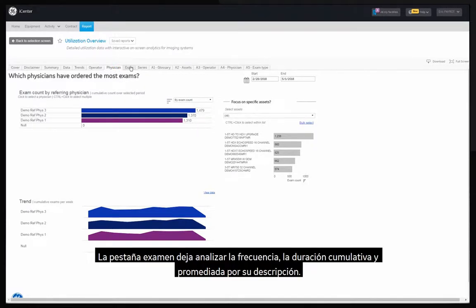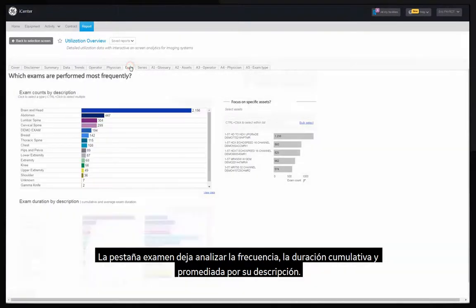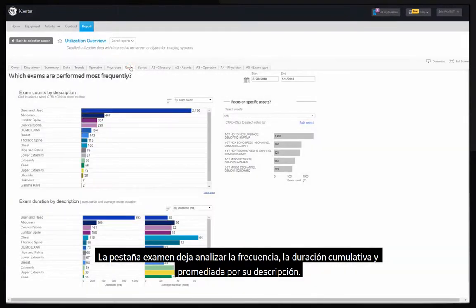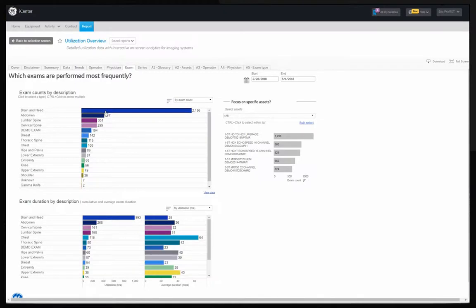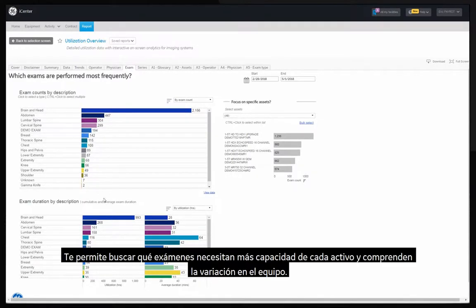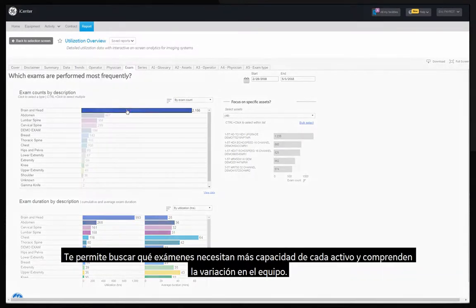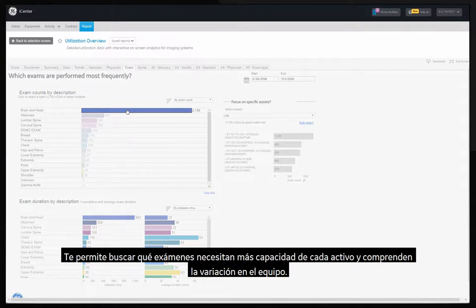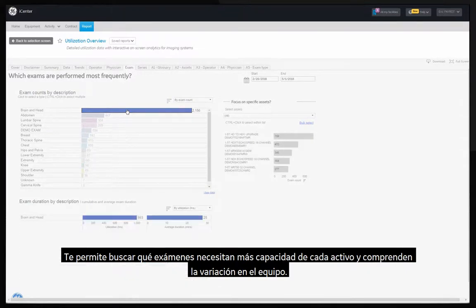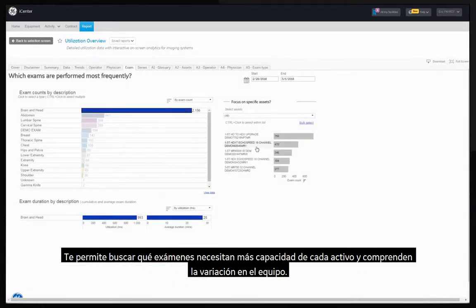The exam tab allows you to analyze the frequency, the cumulative and average duration of each exam by description. It allows you to find which exams take the most capacity of each asset and understand the variation across equipment.